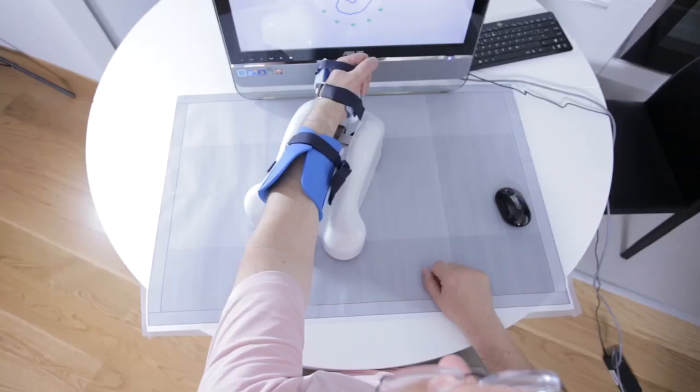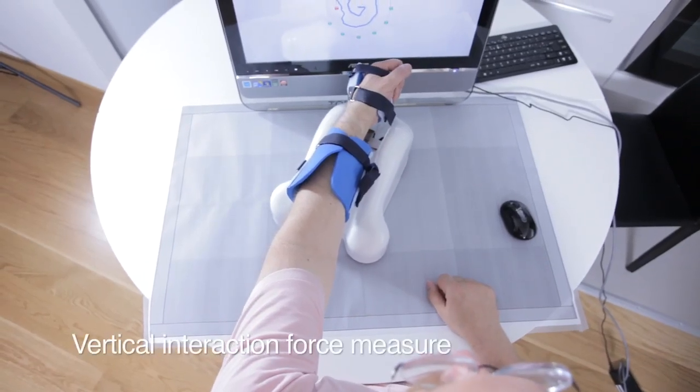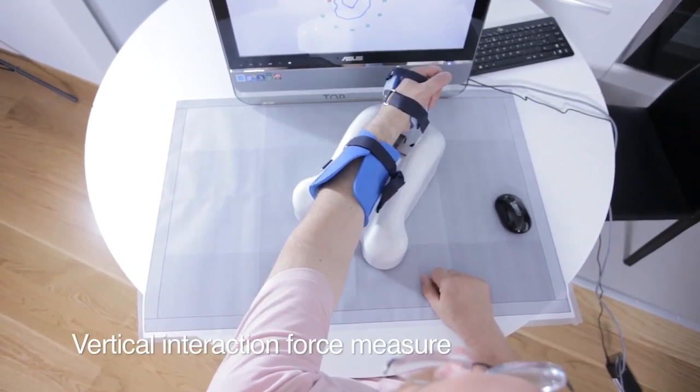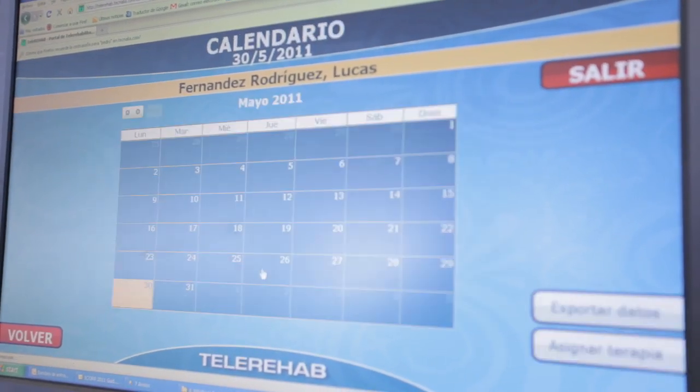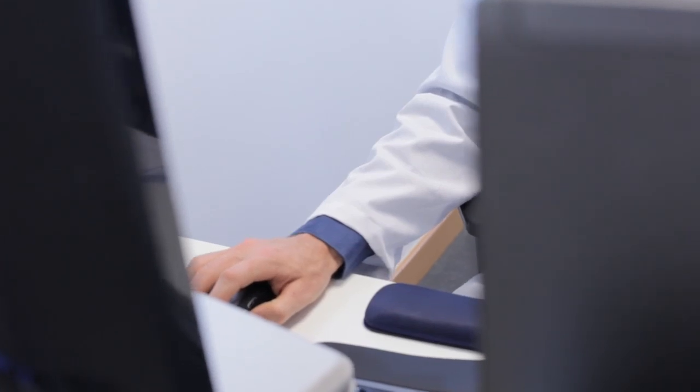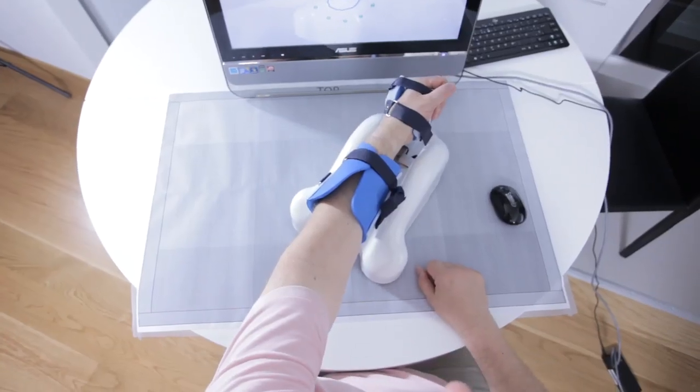The Arm Assist is the only in-home device that measures the amount of vertical interaction forces between the user and device. This measure is important in being able to progressively increase the loading demand on the patient as the active range of motion improves.